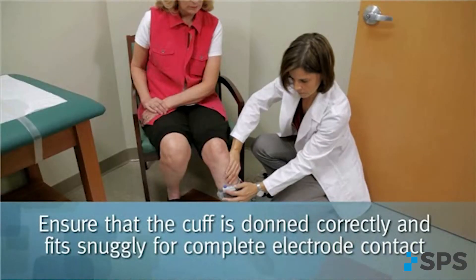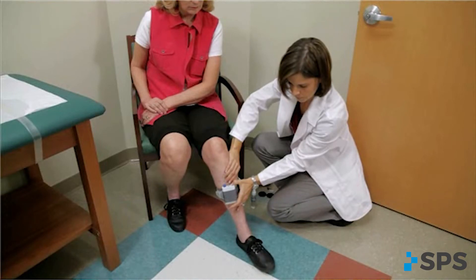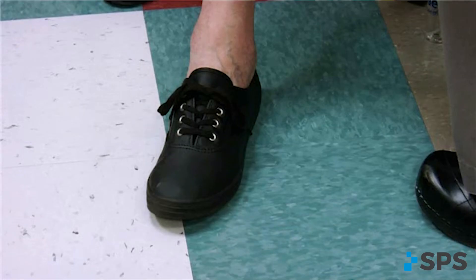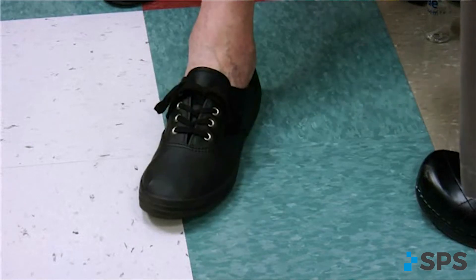Assess the electrodes for proper location and move them as needed. An issue with stimulation timing or missed stimulations warrants a review and adjustment of the WalkAid programming.